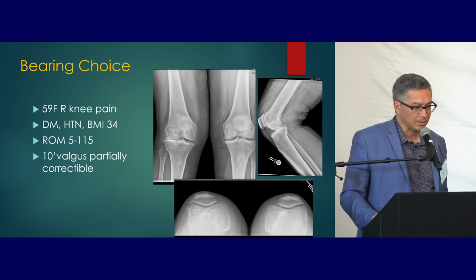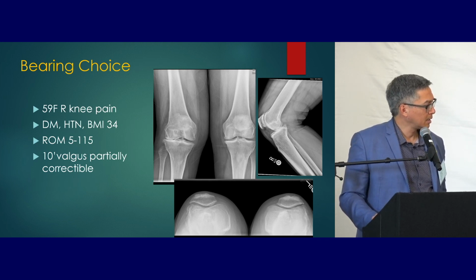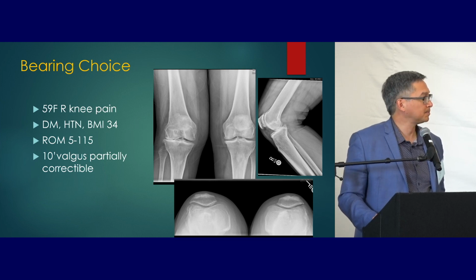So, pretty standard total knee patient. Keith, what's your bearing of choice? So I've pretty much switched to a medial stabilized, medial congruent poly bearing at this point with a CR femur. I was trained traditional PS gap balanced, and now I've pretty much migrated most of my practice to a medial stabilized or medial congruent construct. And that's for all comers, other than severe deformity? Yes. Alfred?